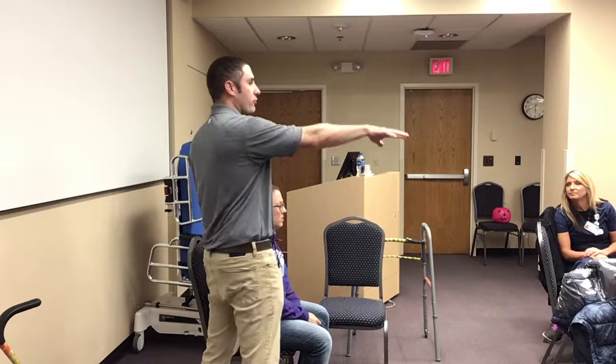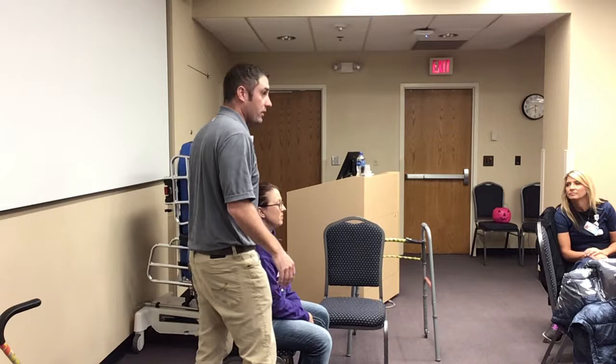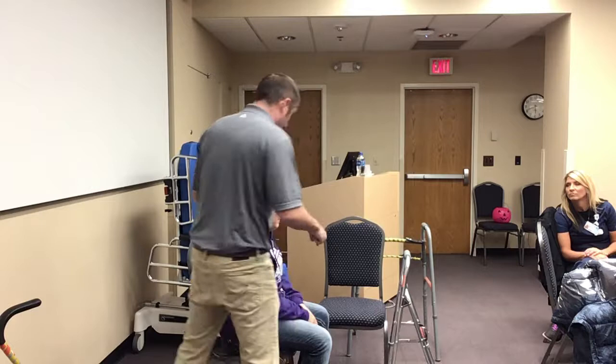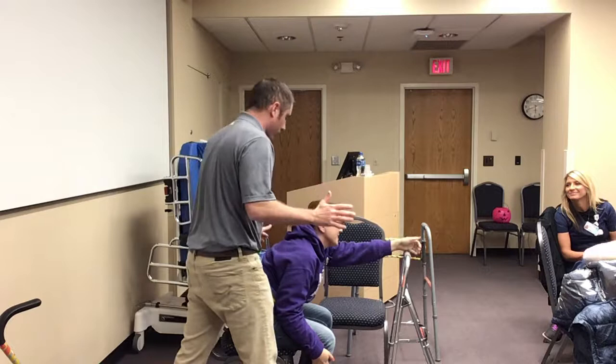Especially with your heavier assist patients, have a plan and maybe a backup plan. If you're thinking 'I'm not sure we're going to make it to the bathroom,' maybe position the recliner halfway to the bathroom so you have a stopping point. You should have a pretty good idea of what's going to happen, but if you're not exactly sure, have a couple of backup plans in place so you're not left in a lurch. We swung the chair around and have a hemi walker in the room. Her first reaction is going to be to reach for it when it's too far away.